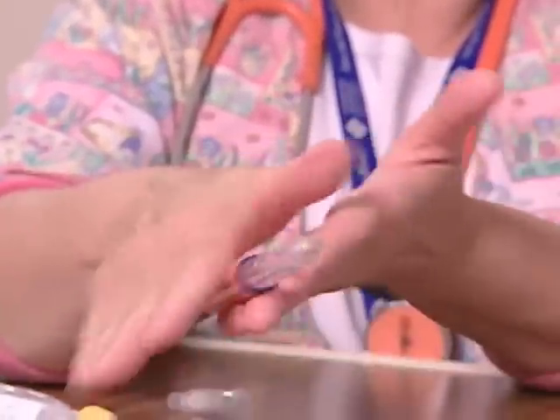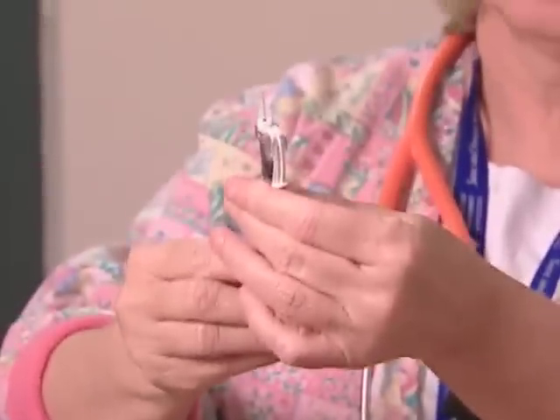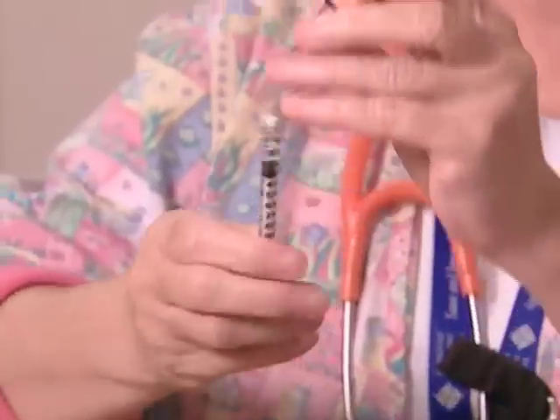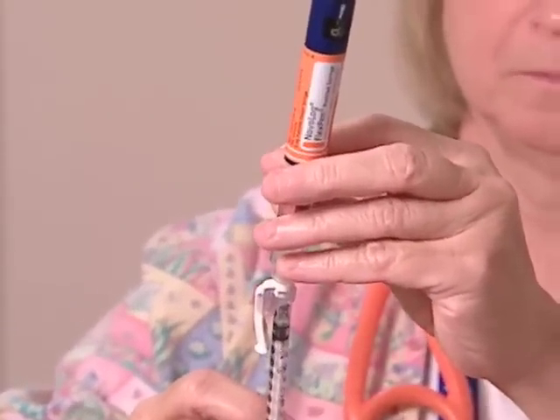Uneven dosing of an insulin suspension can occur if the user fails to tip and roll the pen before the injection, causing the suspension to clump. Sometimes nurses unfamiliar with a particular type of pen will use it as a multiple-dose vial, withdrawing insulin from the pen cartridge with a sterile needle and a conventional insulin syringe. This is not recommended because aspirating insulin from the cartridge can leave air pockets, which can cause dosing errors or air injection when the cartridge is used again.